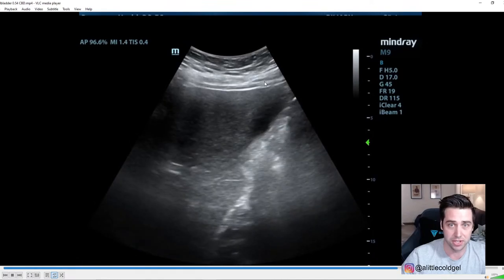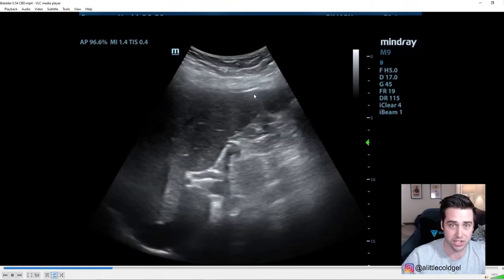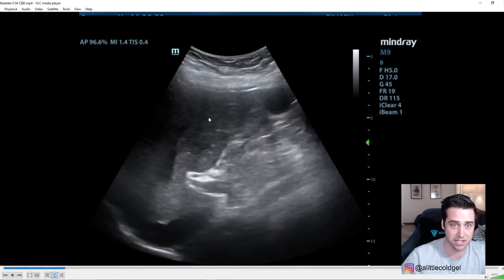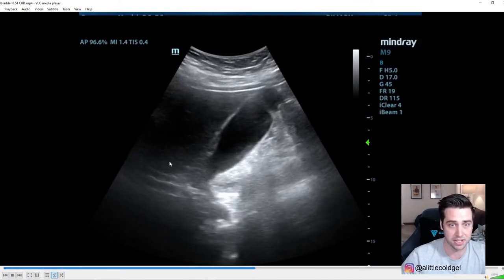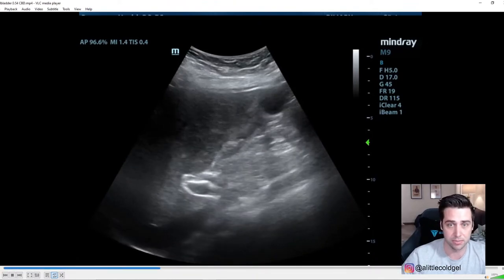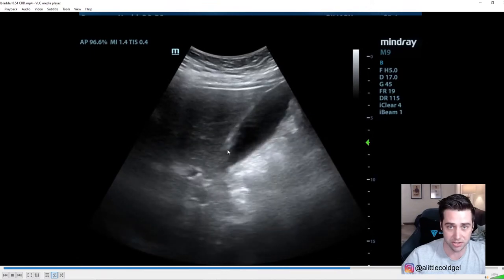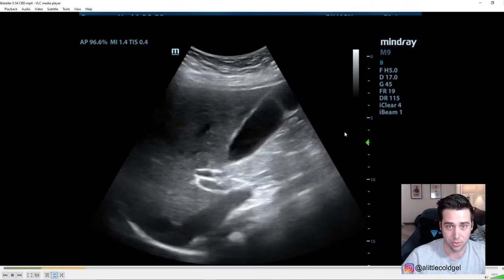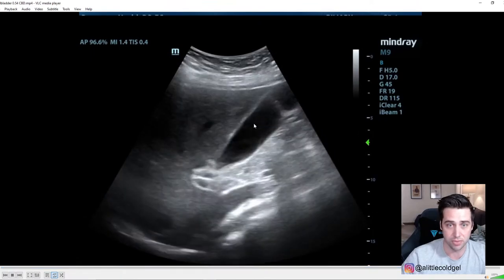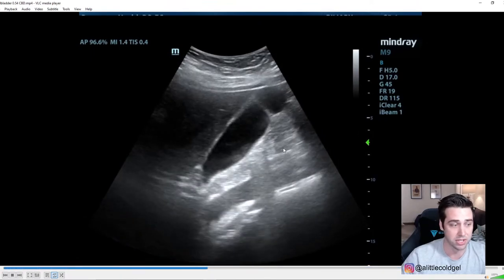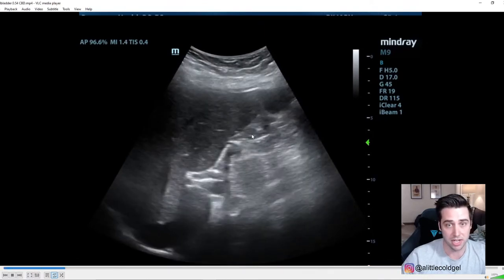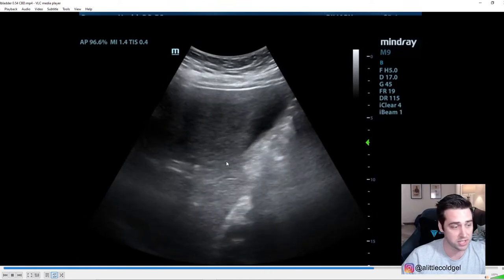Whenever you see that curvilinear footprint you should already have a hint that this is going to be some sort of abdominal imaging. What we have here is soft tissue, then the beginning of your peritoneum, and this darker area is your liver with some vessels running up and down. The thing we're trying to image in this particular scan is the gallbladder. The gallbladder should look like this — a nice bright wall, and it should be anechoic in the middle, meaning no bright echoes.